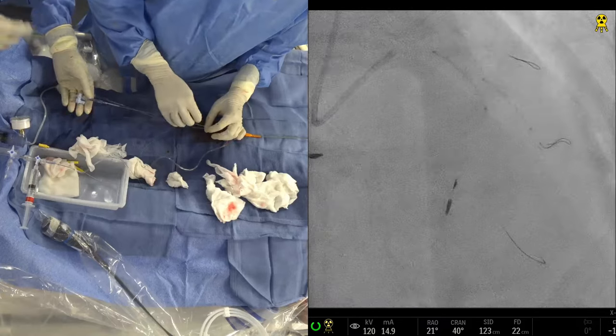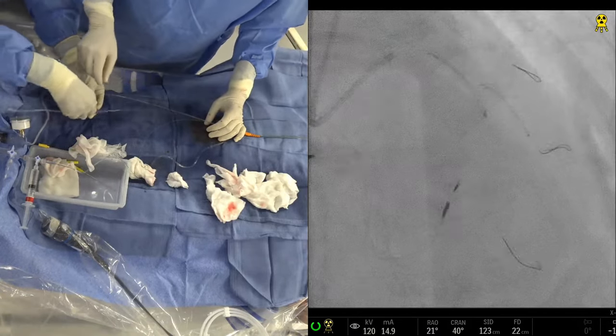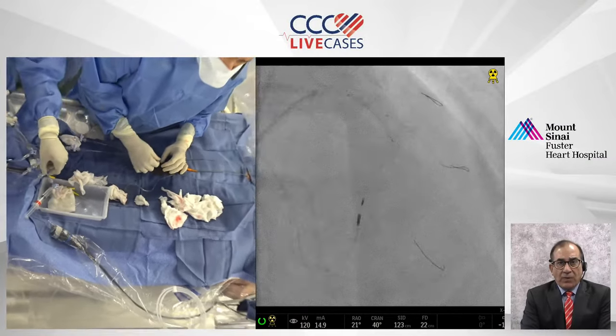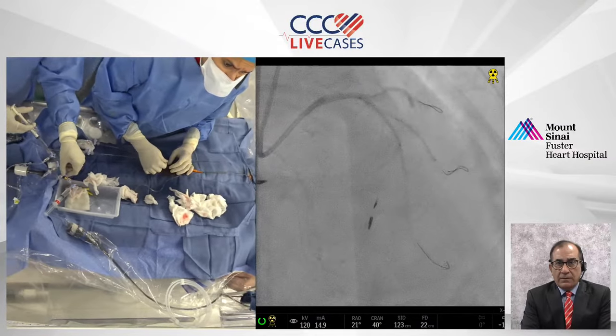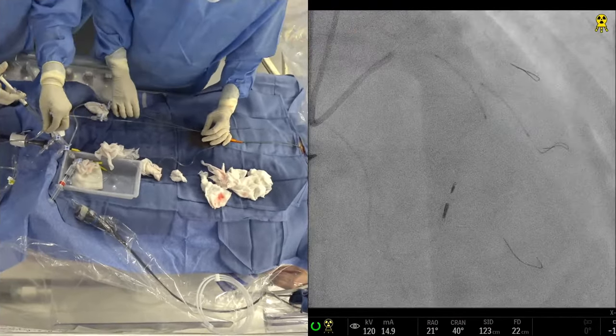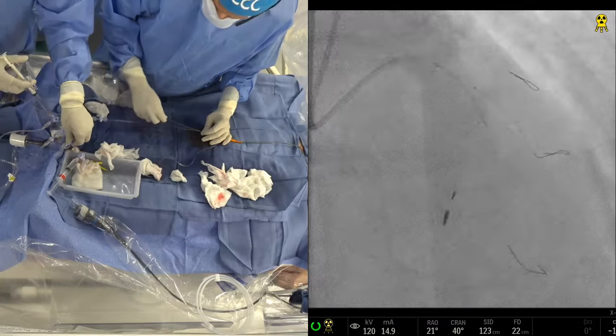That may actually be a very good development because you may be able to include more indications. Some die. Yep. But small vessel is not being done at this time. Right. Total halt. You want to pull back 2 millimeter or you want longer? 38 now. Take a picture. I think we'll be okay.